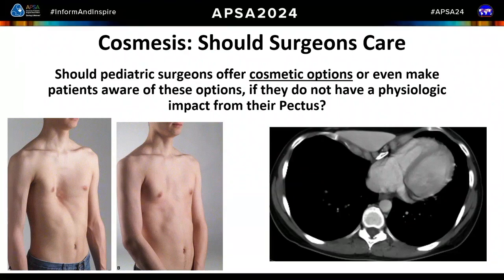Which I think is a good question. We've seen it help. I agree. It doesn't work all the time, but the key thing is compliance. We've looked at our experience with it, and we're going to put this together, but it really makes a difference. If a patient wears it 4 hours a day, 7 days a week, compared to even 4 hours a day, 6 days a week, huge difference in results. Like, you really have to be compliant, and that's a lot to ask. So the way we generally counsel our patients is: vacuum bell, you do the work; NUSS, we do the work.